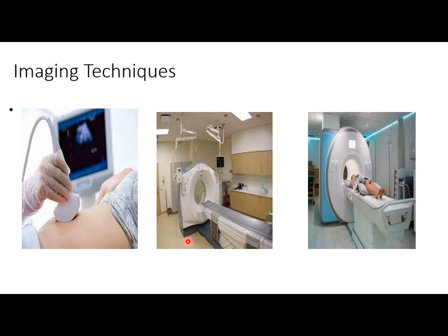Different CT protocols are used according to the patient's clinical features and the clinician's suspicions. For example, a CT protocol at 70 to 80 seconds after contrast administration is used for most pelvic complications like hematoma and abscess.